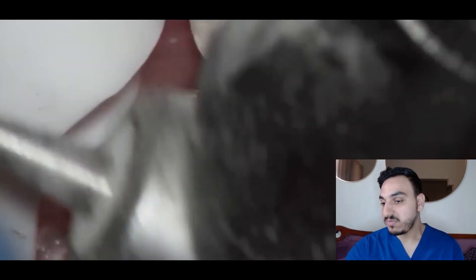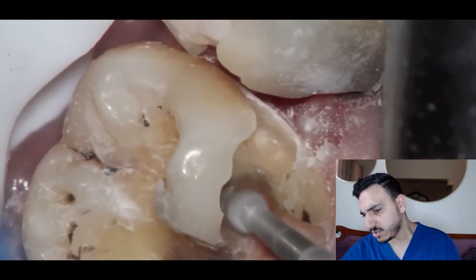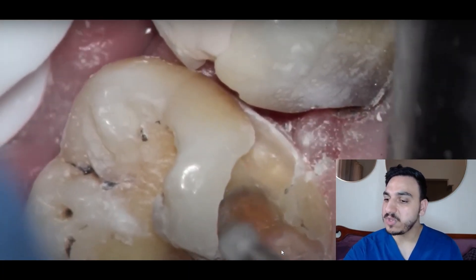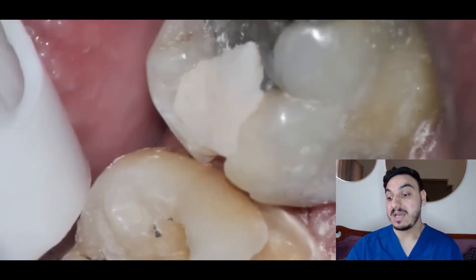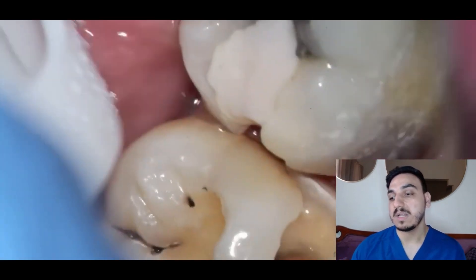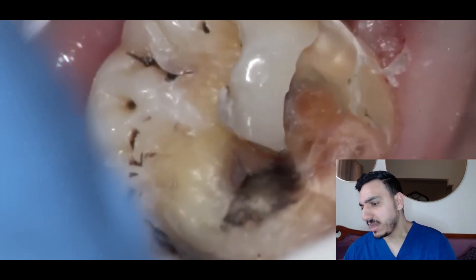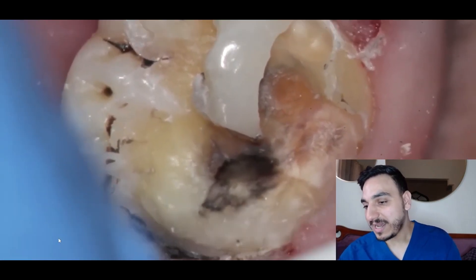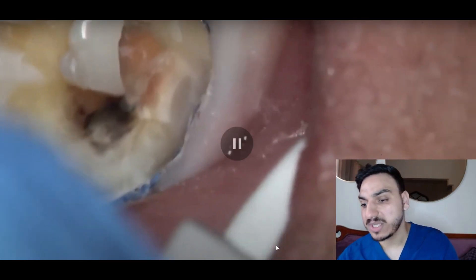There are even some stains there. The operator continues to drill — it's a pretty huge cavity. They're working on the buccal surface, the occlusal surface, and the surface facing the tongue which is the lingual surface. You can notice the operator is being very delicate and careful about how they drill — not pressing too much. Also, they're not using a rubber dam here, which would actually be a good idea. They are now looking at the cavity and reassessing the situation.